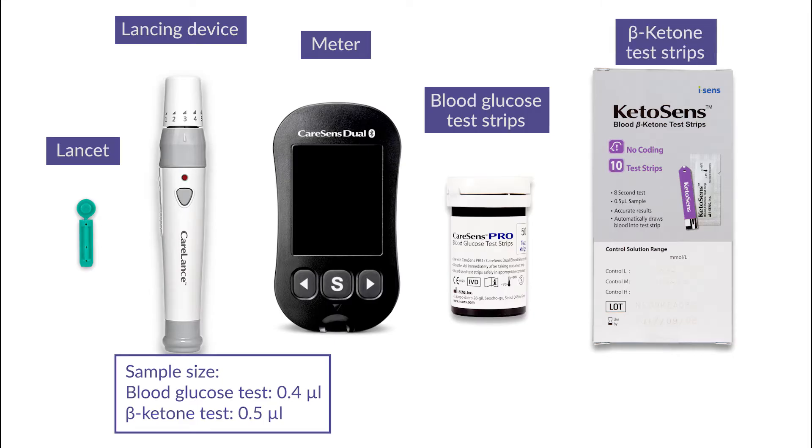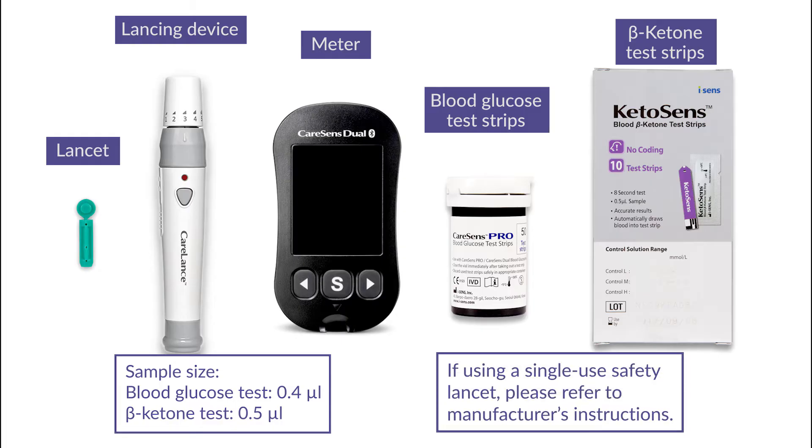A minimum volume of 0.4 microlitres is required for a blood glucose test and 0.5 microlitres for a blood beta ketone test. If using a single-use safety lancet, please refer to the manufacturer's instructions.